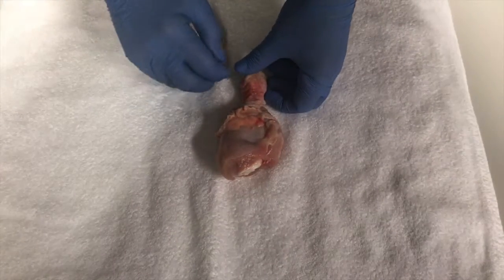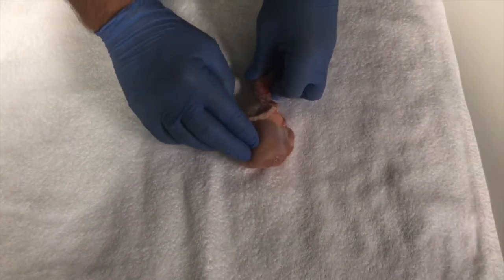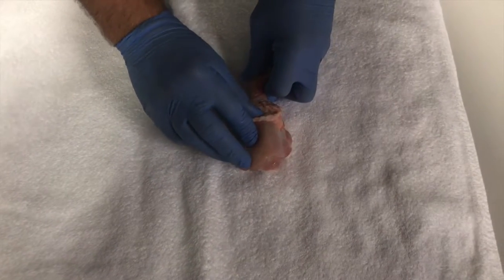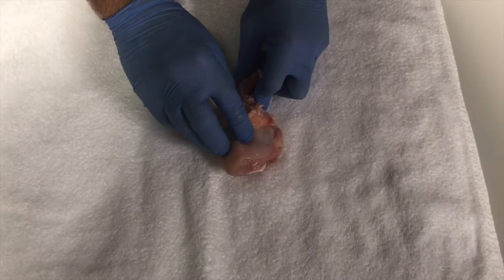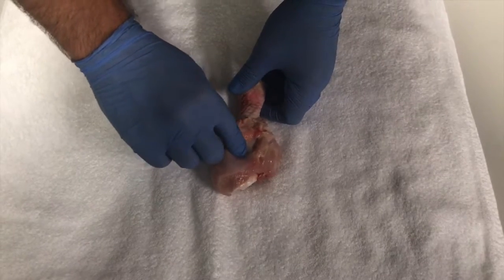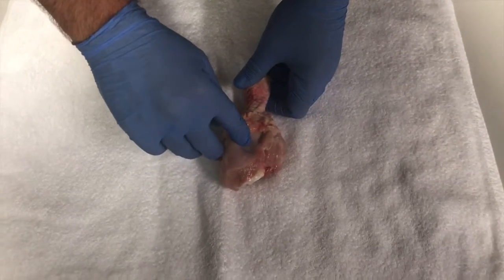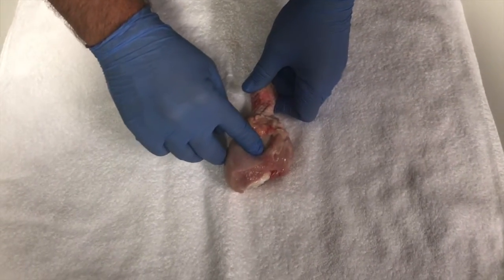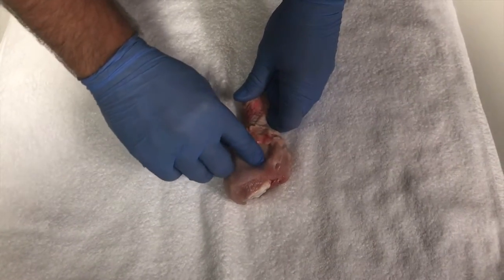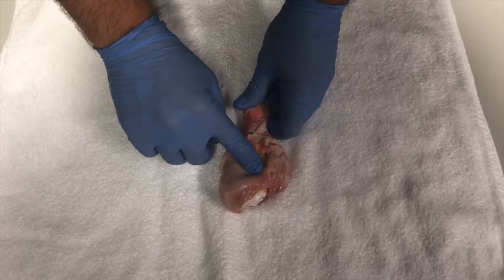To locate the proximal tibial IO insertion site, I come below the patella, which isn't on this chicken drumstick, but I find the tibial tuberosity, which is just distal to the patella. I locate that, and then I come 2 centimeters medially, and I find a flat section of bone just here on the tibia. Now for adults, they say to come back approximately 1 finger width or 1 centimeter, or the manufacturer for the EZ-IO states just to go on this side just here. So tibial tuberosity, 2 centimeters medially, and that's your site, or 1 finger width up, and that's your site there, just on that flat section of bone.